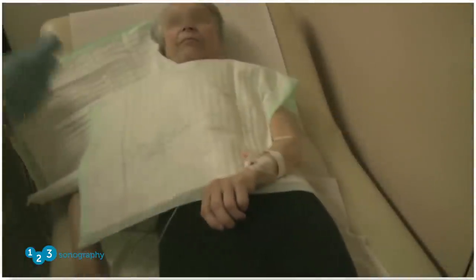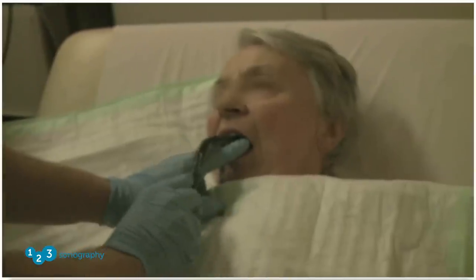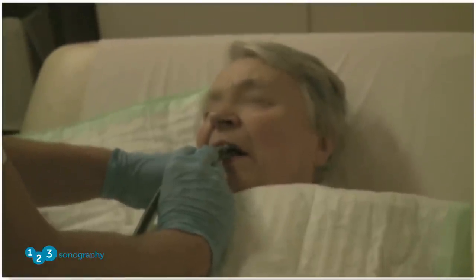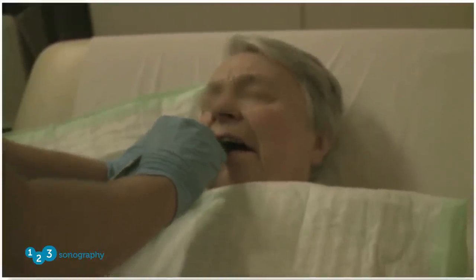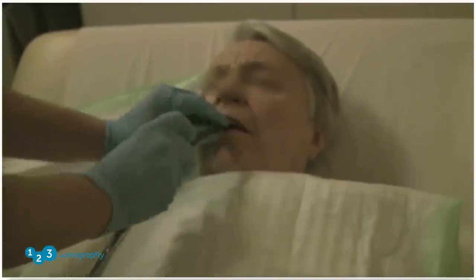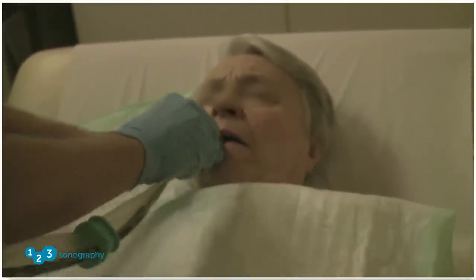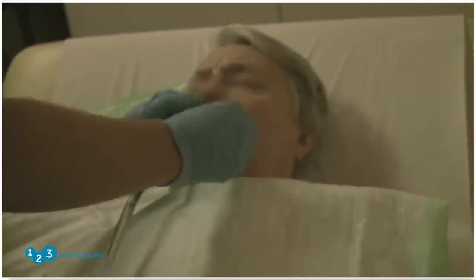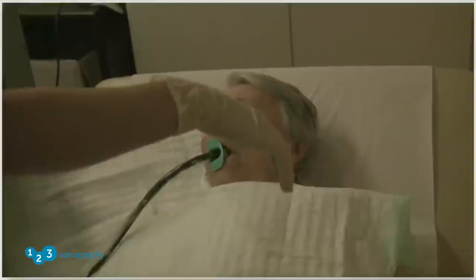Then we start the sedation — approximately two to five milliliters of midazolam — and wait until the patients respond. We shield the probe with our fingers and gently introduce it while asking the patient to breathe calmly and, if necessary, to swallow. The patient is in a slight left lateral position. You usually feel when the resistance is gone and you're in the esophagus. Never apply too much pressure, as this can cause complications. Once the probe is in place, we shield it with a mouthpiece since the probes are expensive and sensitive to biting.